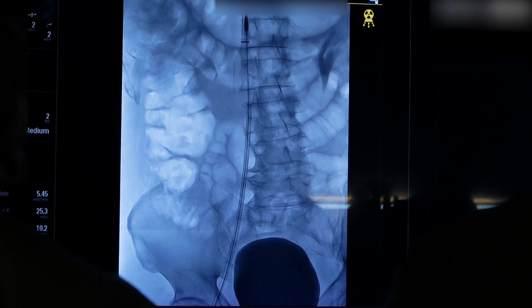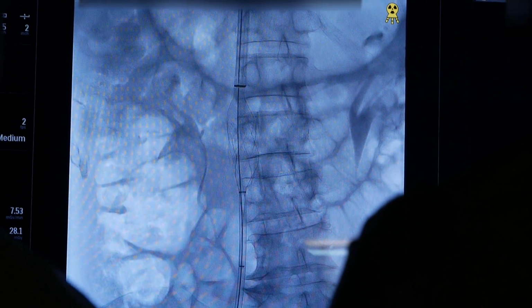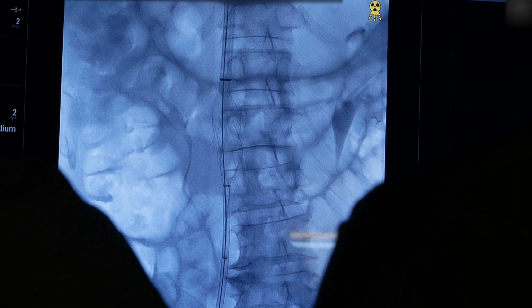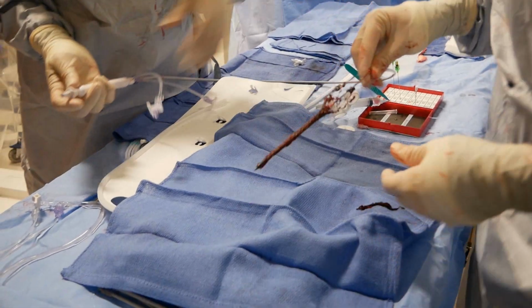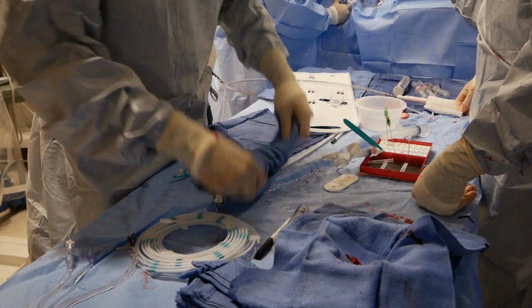The thrombectomy device we used is called a ClotTriever device, and it basically acts as a mesh that we can open and close. We use that once we're in the vessel at the level of the clot. You can see it open on the fluoro, and it's basically a big cage that will trap the clot. When we remove the ClotTriever, you have to whip it against a towel to get all the clot out.